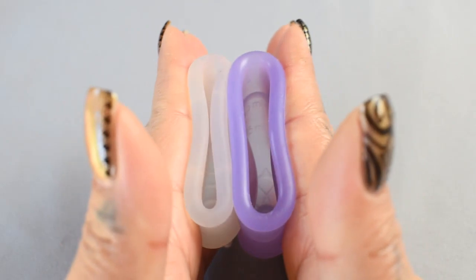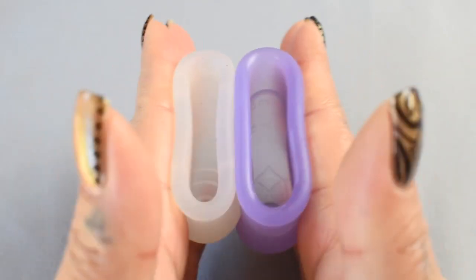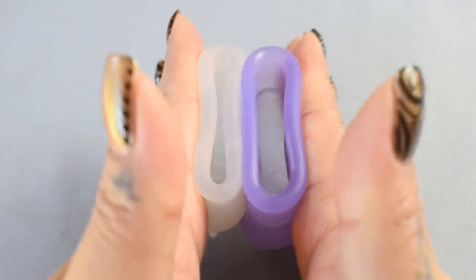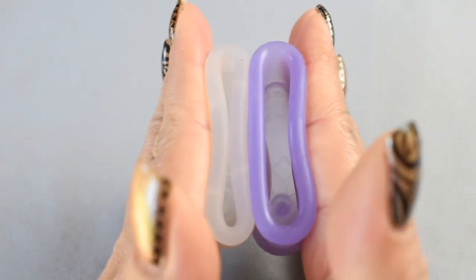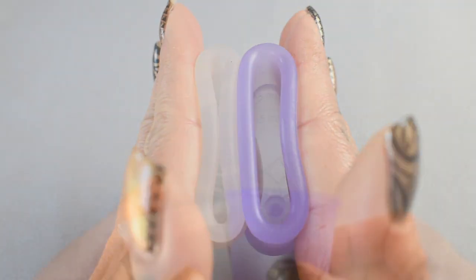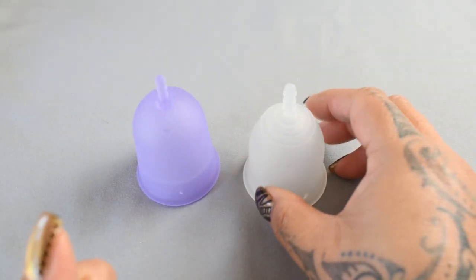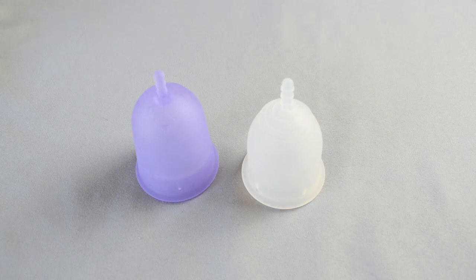And just the rims. That was the Venus cup and the Lena cup in the sensitive version, both in a size large.